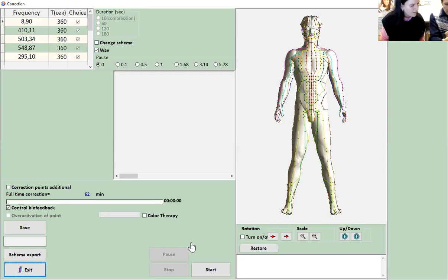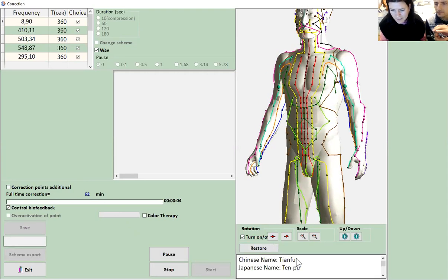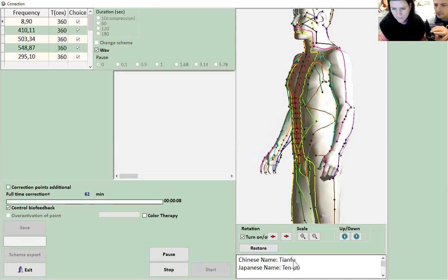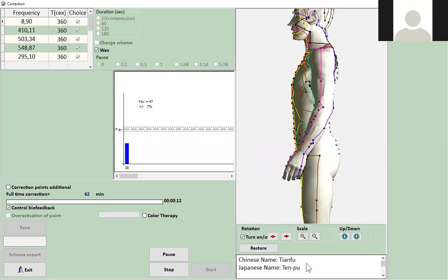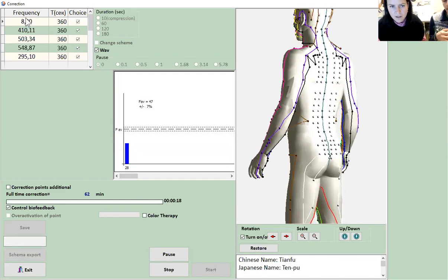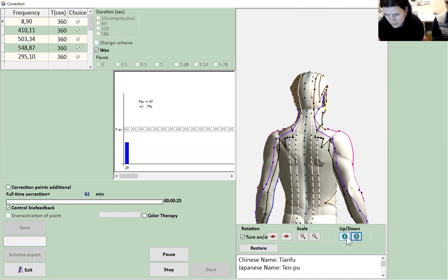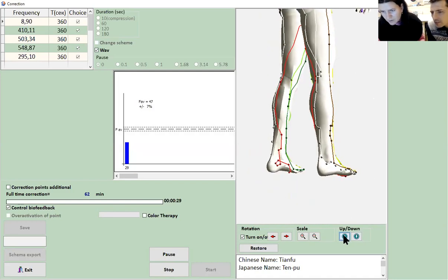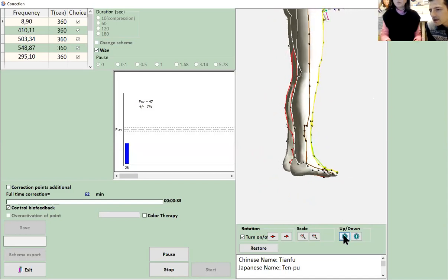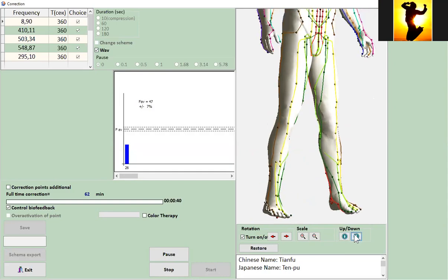So look. Here, when we do the treatment directly, we will start here. You see here the Chinese name of the frequency of the points. You see the point names. Yes, and you can see which point. This one also has frequencies up in the left corner. This one is on 8.9 frequency, and now we're searching where it is. It has to be a fat one. It should be blinking also. Sometimes it's not blinking, just a little bit bigger. But sometimes you cannot find it easily.